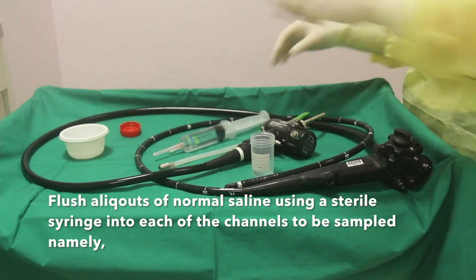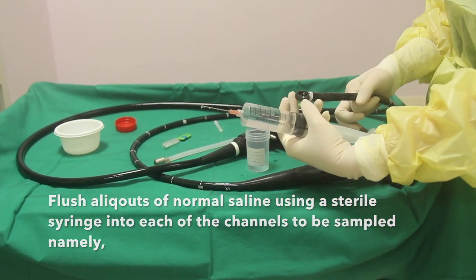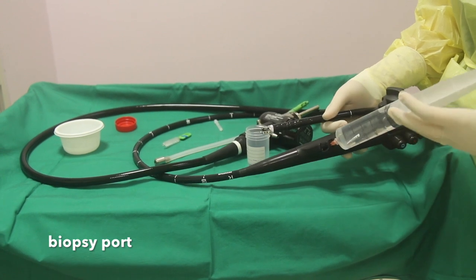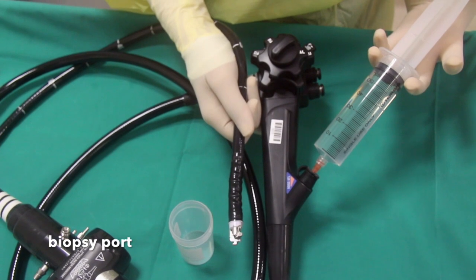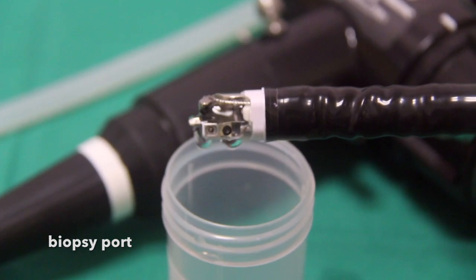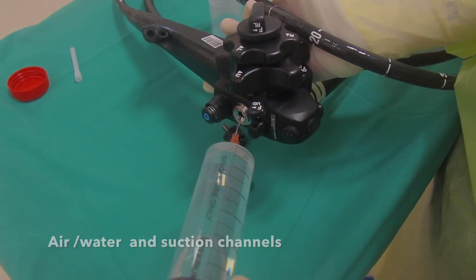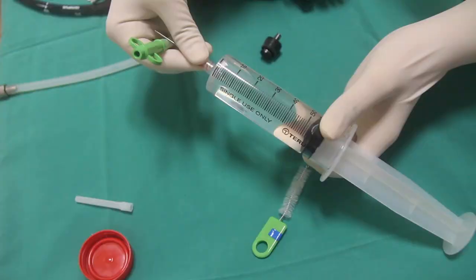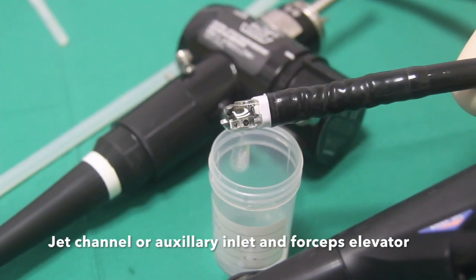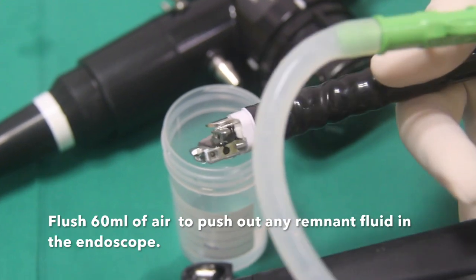Flush aliquots of normal saline using a sterile syringe into each of the channels to be sampled, namely the air, water, and suction channels, and the jet channel or auxiliary inlet and forceps channel. Then flush 60 ml of air to push out any remnant fluid in the endoscope.